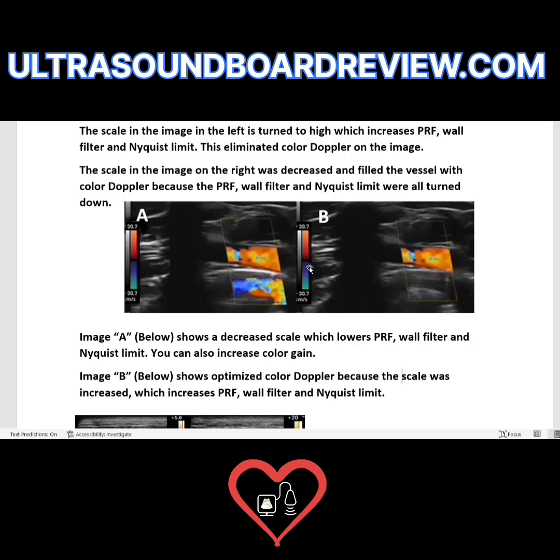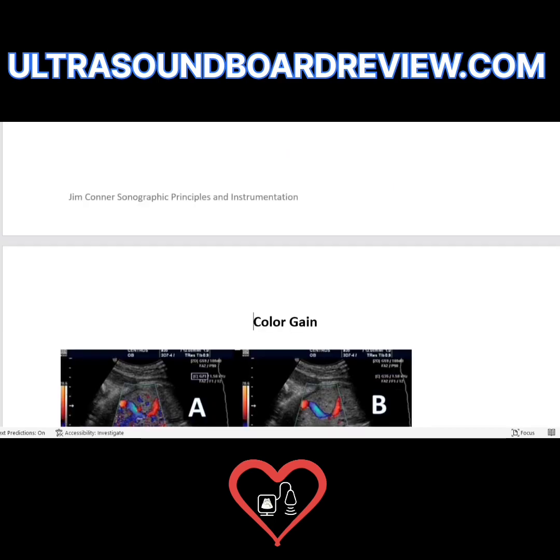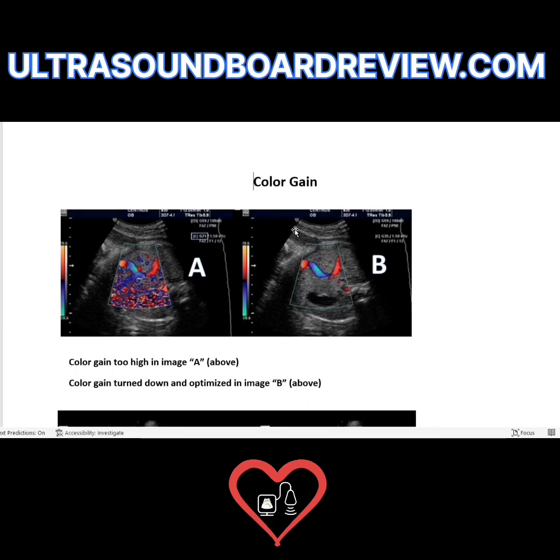There are two options: you can either change your angle to fix it, or you can decrease your gain. Color gain is a tricky setting — if you turn it up too high, you get confetti-like speckle throughout your color box.